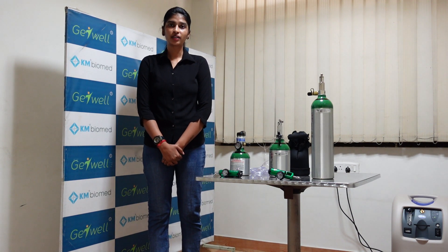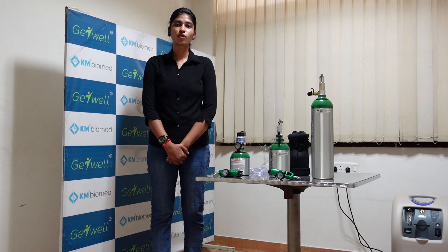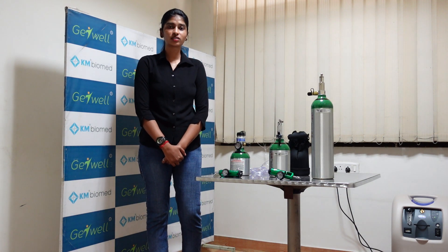Hello everyone, I am from KM Biomed. We are one of the distributors for InvaCare in India. Today I am going to explain you about the various types of InvaCare oxygen cylinders.